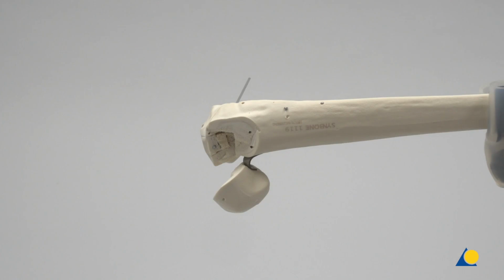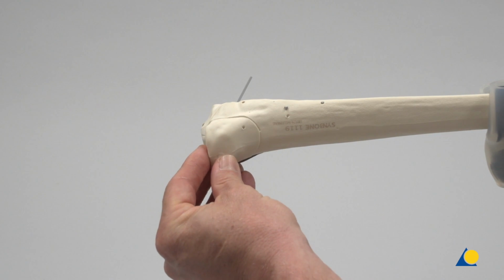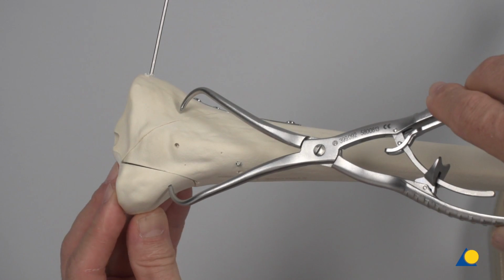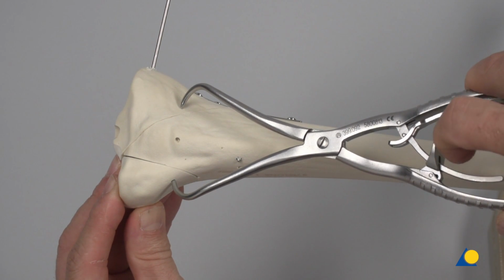The lateral fragment is reduced and held in position with the pointed reduction forceps. Note that, in the clinical situation, correct positioning of the pointed reduction forceps can pose a challenge.